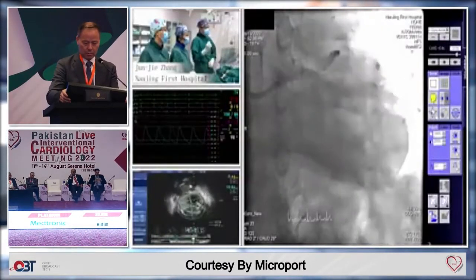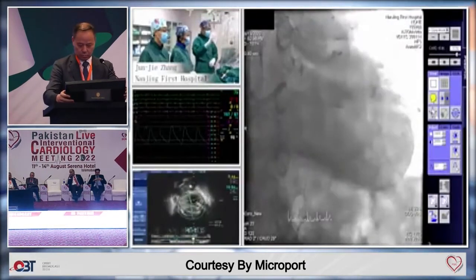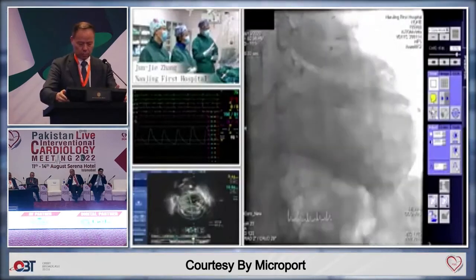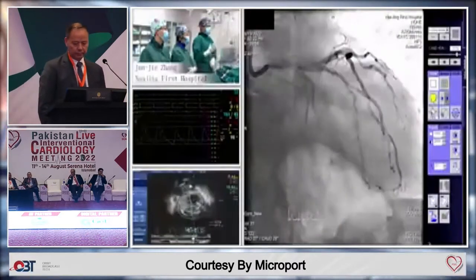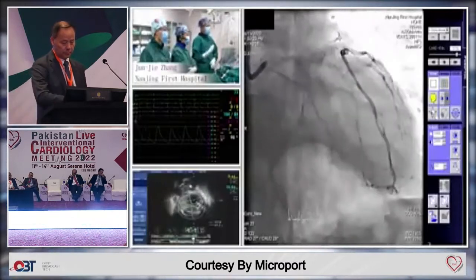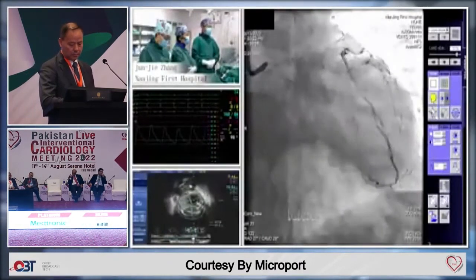You can see there is a severe calcification at the distal left main extended to proximal LAD. And from this view, you cannot distinguish the ostial circumflex. Next. So this is the RAO caudal view. You also can see the first obtuse marginal branch is larger than distal circumflex.